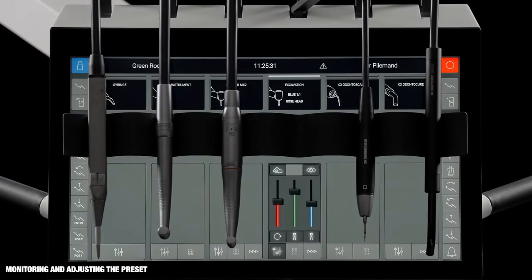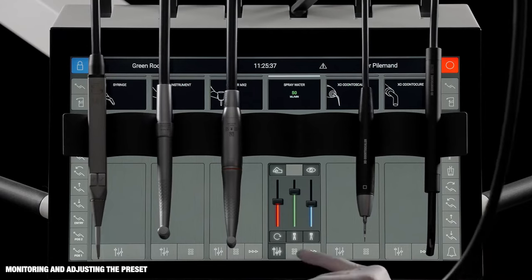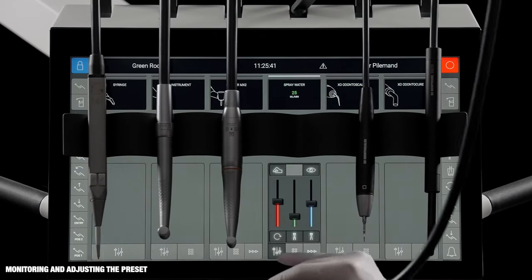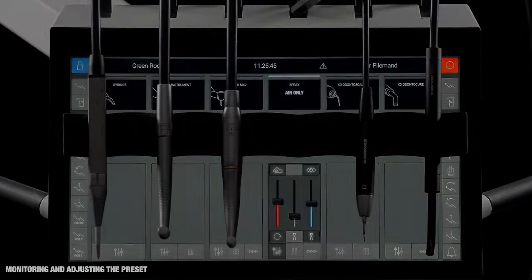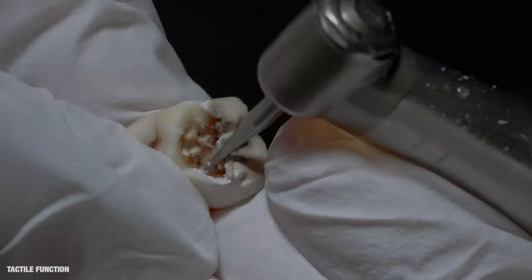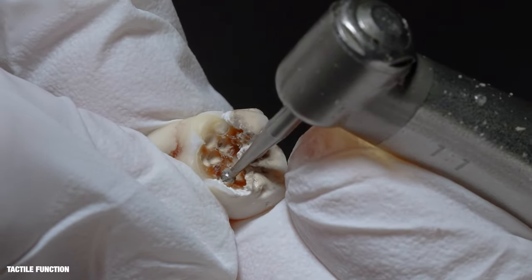It's possible to monitor and adjust a preset. Tap the green slider and see the amount of spray water. Adjust the spray water if necessary or switch spray water off. In the excavation preset, the tactile function is enabled — the burr will stop rotating when touching healthy dentine.